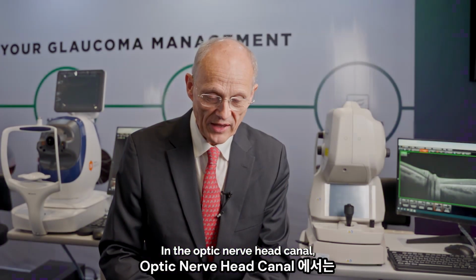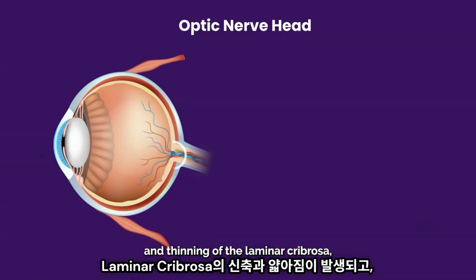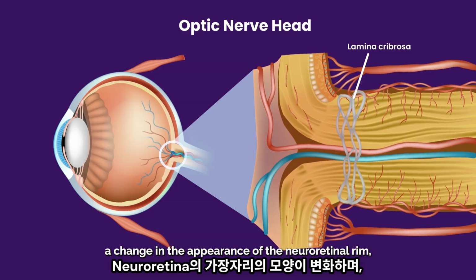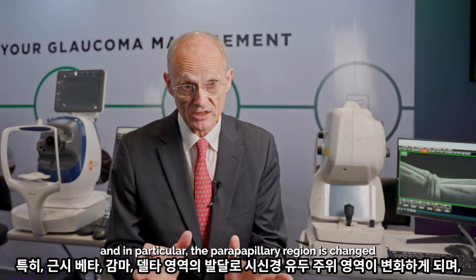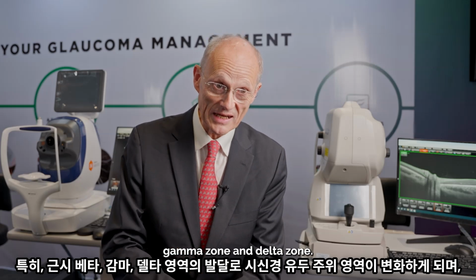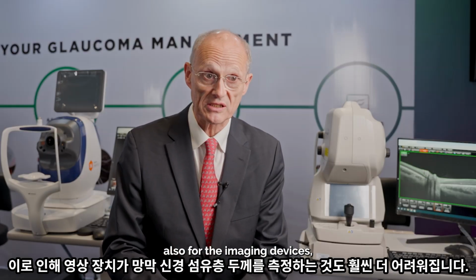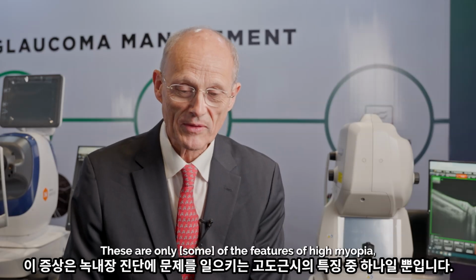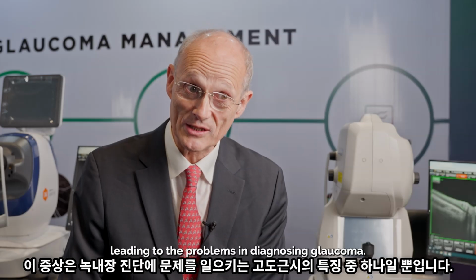In the optic nerve head canal, you get a stretching and thinning of the lamina cribrosa, an enlargement of Bruch's membrane opening, a change in the appearance of the neuroretinal rim, and in particular the parapapillary region is changed due to the development of the myopic beta zone, gamma zone, and delta zone. And all this makes it much more difficult also for the imaging devices to measure the retinal nerve fiber layer thickness there. These are only some of the features of high myopia leading to problems in diagnosing glaucoma.